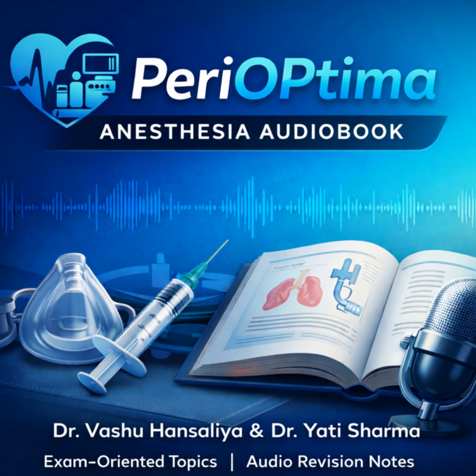That's right. So the machine's fail-safe systems use what's called a pneumatic ratio regulator, or a proportional linkage. It's a mechanism that links the flow of oxygen and the flow of nitrous oxide. So they aren't independent. Not at all. If the oxygen pressure falls, the system automatically, proportionally, reduces or completely cuts off the flow of nitrous oxide. This makes it mechanically impossible to deliver a dangerously low oxygen mixture.